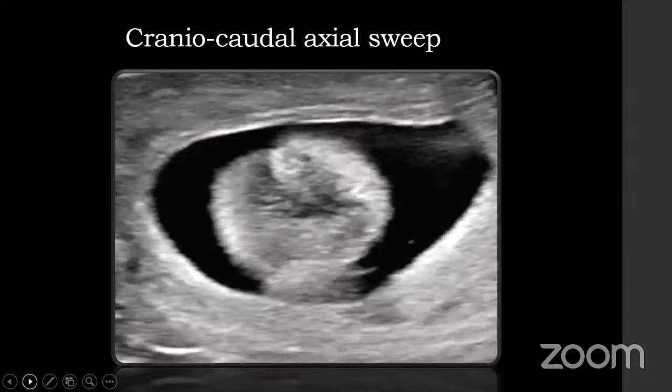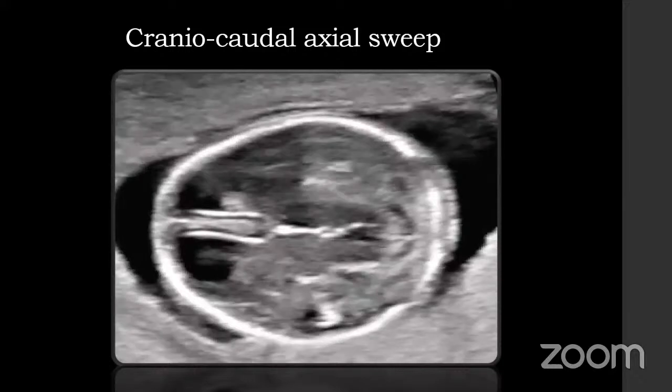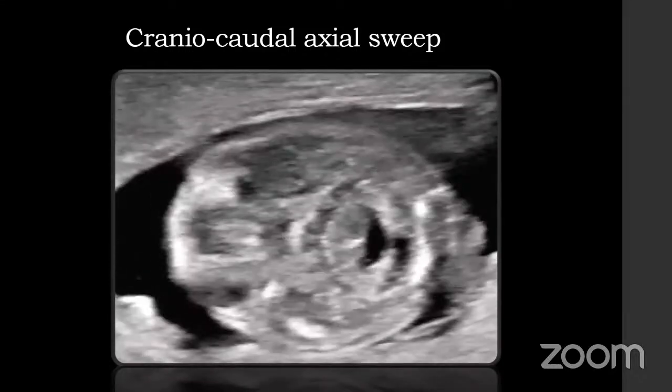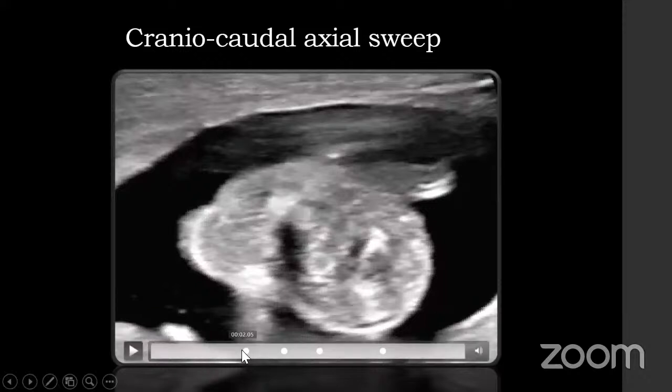So you might be wondering, it might take a lot of time. Initially, there's a learning curve involved. But once you go through the learning curve, it's just one sweep. I just have to take one sweep. That is the transventricular, transthalamic, transcerebellar. It is just one sweep, which hardly takes 10 seconds.